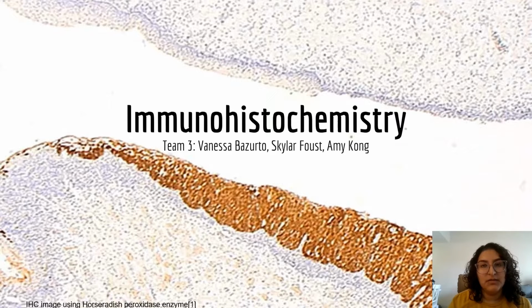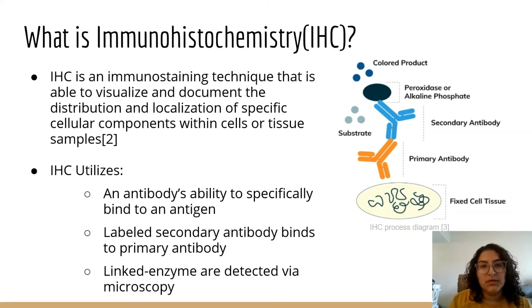My name is Vanessa and Skylar and Amy are my teammates, and today we'll be talking to you about immunohistochemistry. So immunohistochemistry, or IHC, is an immunostaining technique that is able to visualize and document the distribution and localization of specific cellular components within tissue samples.